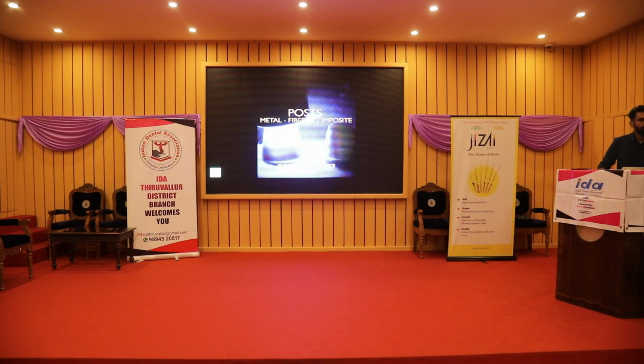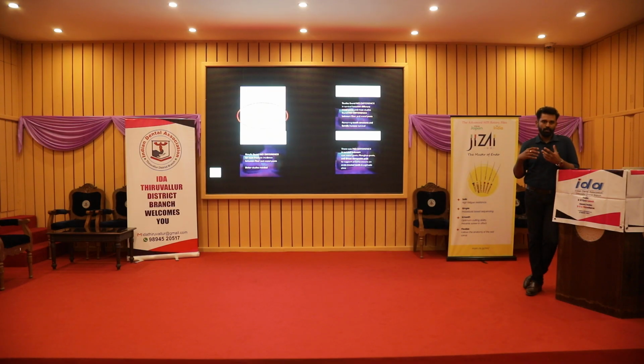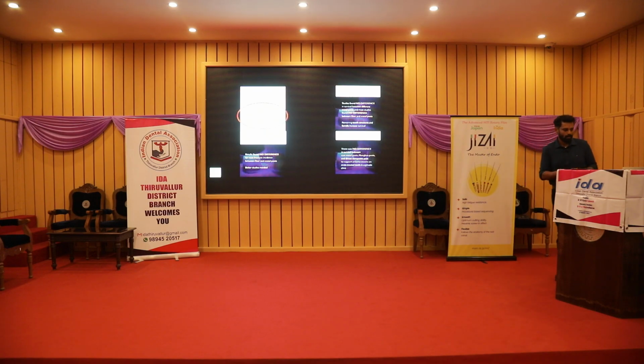Again, next question: which post, metal or fiber? Why? Studies show that the success rate is almost the same, fiber post or metal post. The only thing is survivability, that is, if it fractures, a metal post is going to be catastrophic. That means it can fracture in such a way that you cannot redo it. If you are going with a fiber post, the chances of redoing are very high. Even if it fractures, you can redo it. So survivability is almost the same, but if it fractures, it is going to be bad for your metal post.